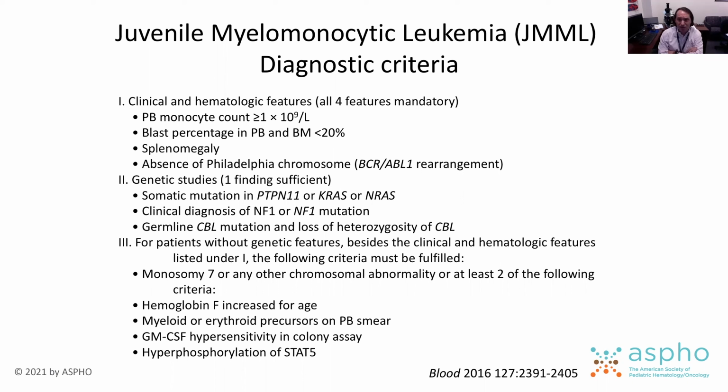The diagnosis of juvenile myelomonocytic leukemia is evolving. It used to be a diagnosis based upon a series of select 2 from this category, 1 from that category. Now it's substantially been supplanted by the detection of RAS-MAP kinase mutations in patients with otherwise typical clinical features.